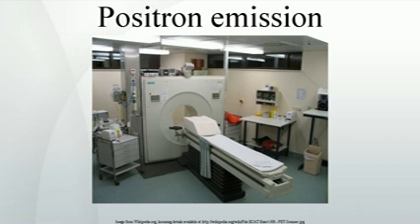Contemporary scanners can estimate attenuation using integrated X-ray CT equipment. However, earlier equipment offered a crude form of CT using a gamma ray, positron-emitting source and the PET detectors. While attenuation-corrected images are generally more faithful representations, the correction process is itself susceptible to significant artifacts. As a result, both corrected and uncorrected images are always reconstructed and read together.